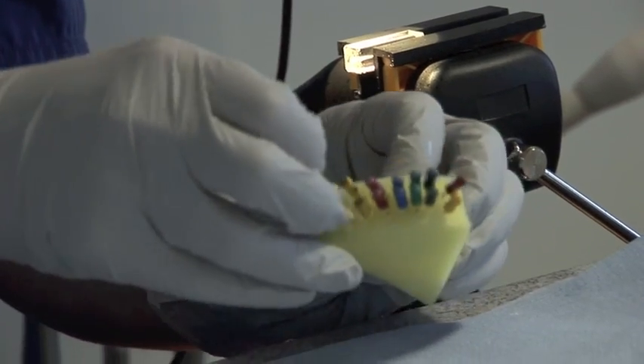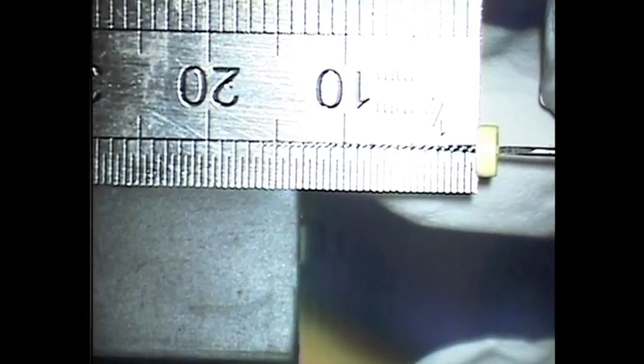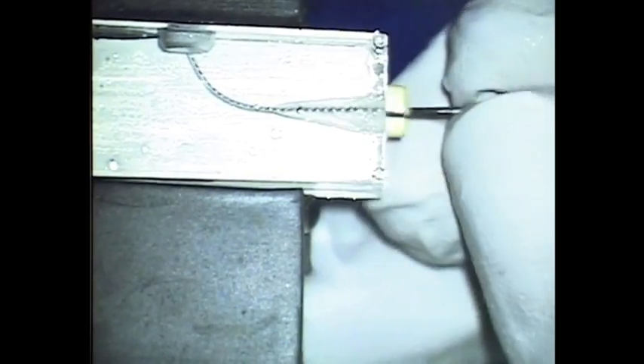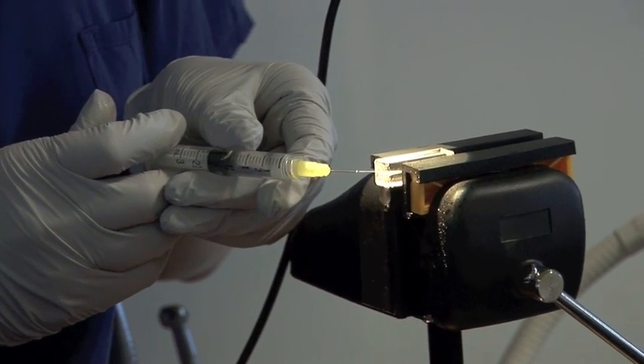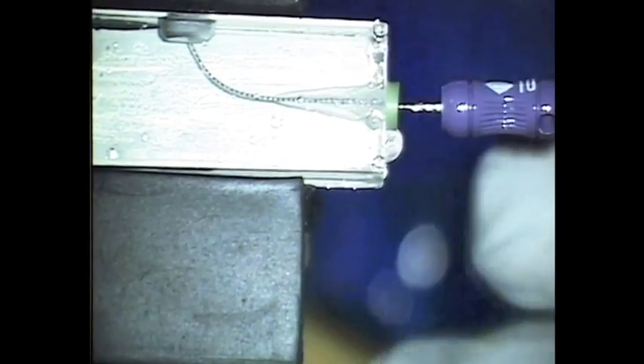I'm now going to pick up my size 15 file and measure it to 16 millimetres. I'm going to place the size 15 in the canal and see if that goes to length — and it does. Sometimes this doesn't happen; sometimes the file doesn't go in easily, but in this case it has. You can see the backwards and forwards motion and the watch winding. Now it's really important to use the irrigant again — any debris is run through — and then I use my patency file again to make sure there are no blockages.